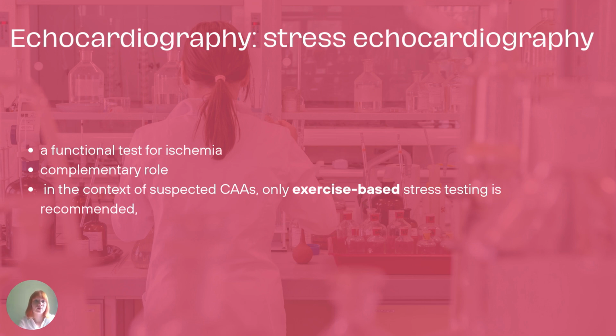What about stress echocardiography? It is a functional test for ischemia and plays a complementary role to previously described methods. And what is important in the context of suspected coronary artery anomalies, only exercise based stress testing, no pharmacological testing, is recommended.